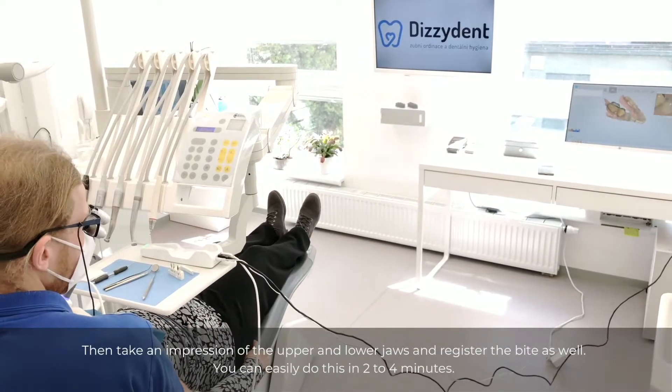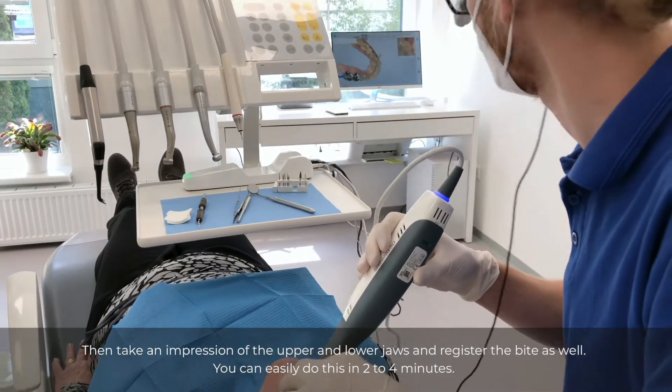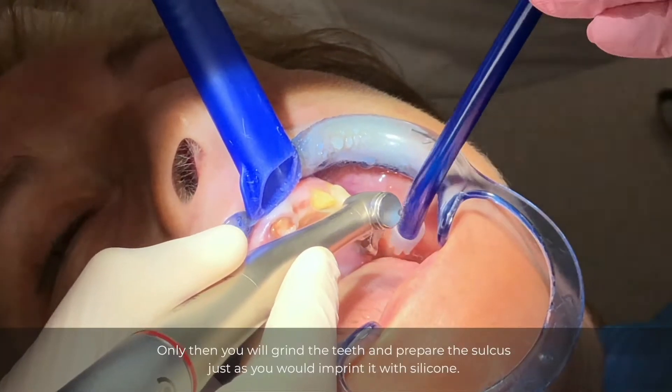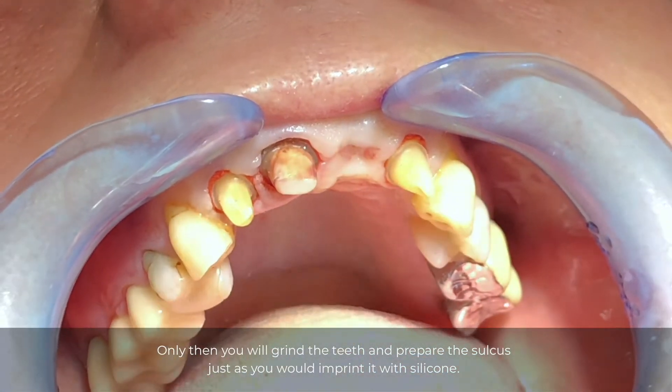Take an impression of the upper and lower jaws and register the bite as well. You can easily do this in two to four minutes. Only then you will grind the teeth and prepare the sulcus, just as you would imprint it with silicone.